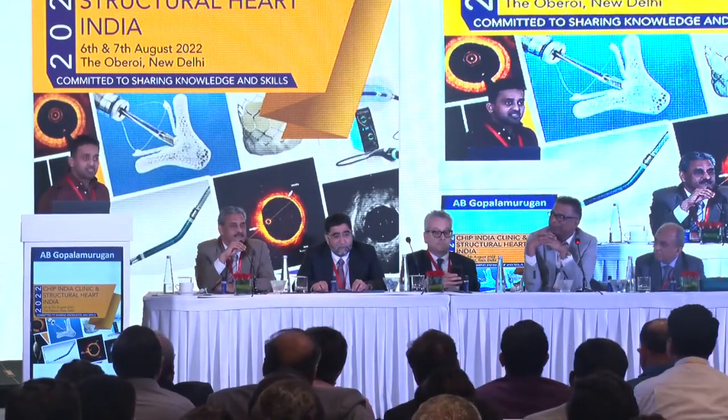There are some animated posters and videos where the layman people are sending the laser diagonally. But a lot of people think that animation is inside the coronary, and that is dangerous, so please don't do that. This is not for coronary. In coronaries, unless you have a wire, it should not be done. That will be my point, Dr. Mehta.